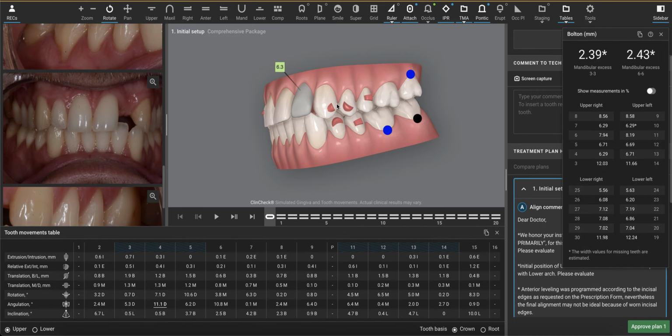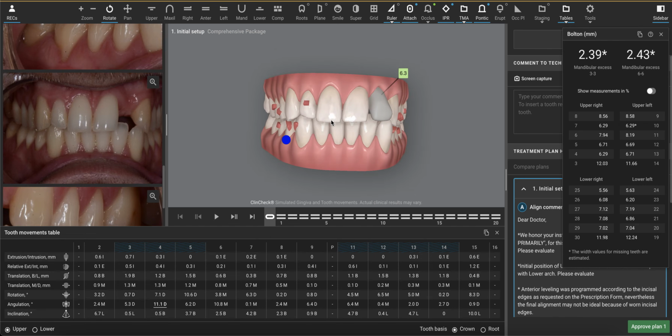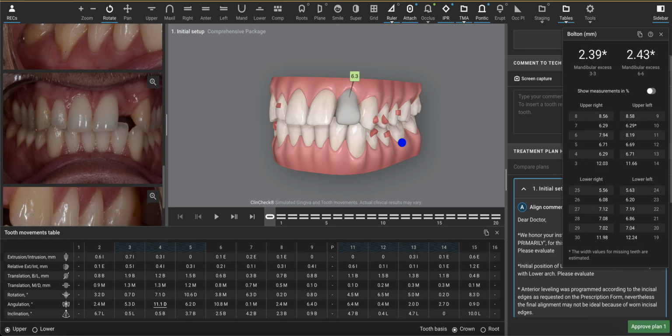But coming back to the problem with the Bolton, it's these narrow teeth that I think is the problem. So my suggestion, based on the hunch that there's an airway problem, is that we actually increase space here and veneer the 4 front teeth as part of an aesthetic rehab to fill this. So I don't know what the plan is, whether it's an implant or a bridge. You had sent me a photo of this here, this cantilevered bridge or cantilevered single unit bridge.